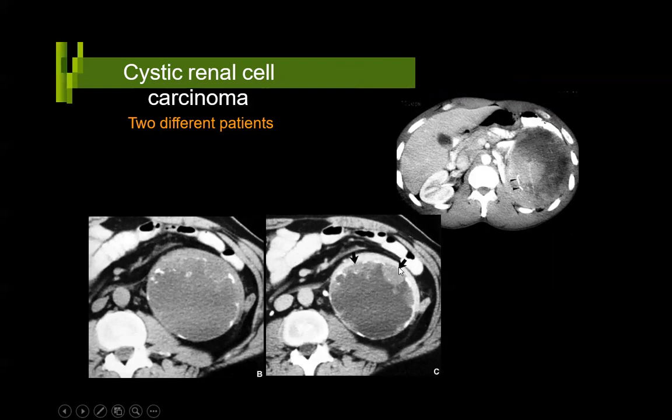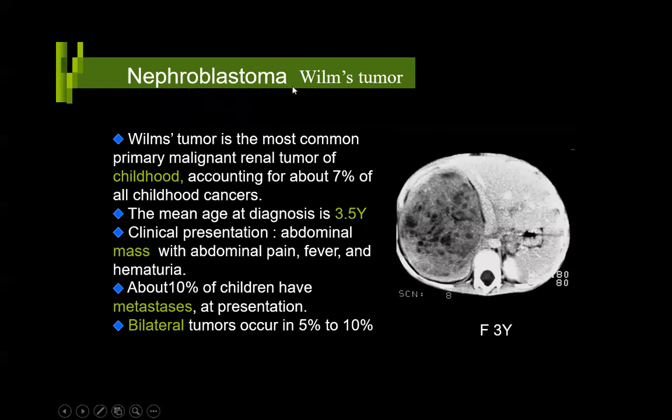These renal cell carcinomas are less frequent, and their malignant potential is less compared to the ordinary RCCs. In children, remember, the more frequent tumor is going to be Wilms tumor or nephroblastoma. Usually in the first or second decade, they present with a large mass, sometimes like this, and you can see that the kidney is stretched around it. If you see some part of the kidney stretched around it, it gives you a sort of claw appearance. So these are childhood tumors.